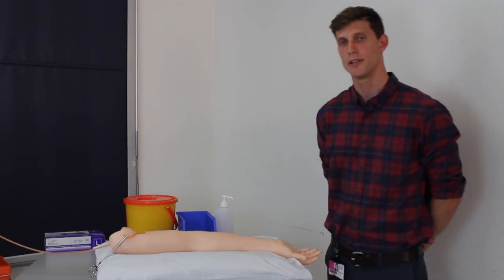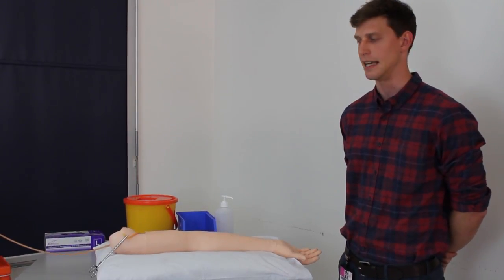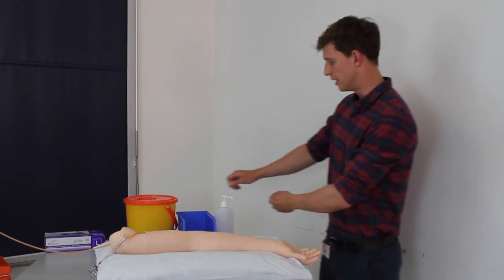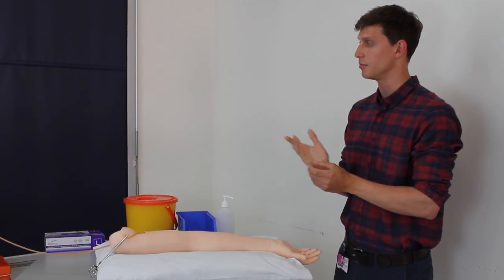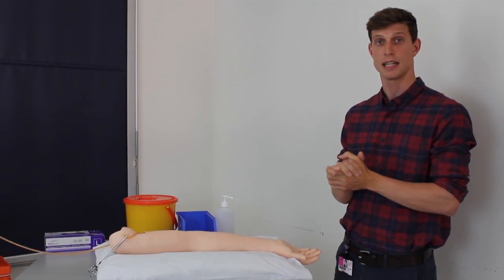Hi there, my name is Tom Searle, one of the fifth year medical students, and I've been asked to perform an arterial blood gas today. I'd come in, wash my hands, and introduce myself to the patient.